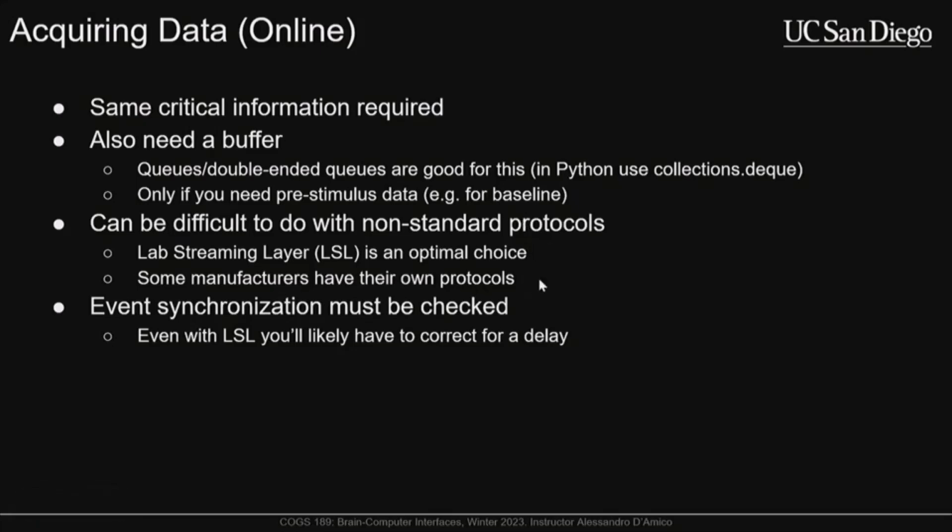And some manufacturers make their own protocols. Usually they're based off of UDP or OSC, which is the Open Sound Control protocol. I know SuperCollider uses that. Anybody use SuperCollider here? Music synthesis software. It's cool.